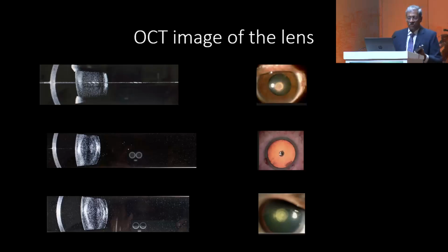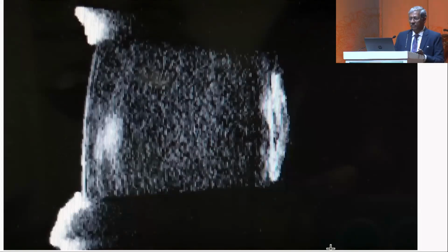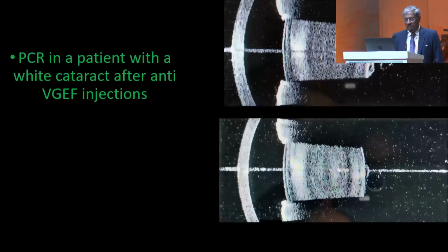The OCT also gives you an OCT image of the lens. We all deal with posterior polar cataracts, and we are worried that we're going to have a problem intraoperatively. But when you see a beautiful posterior capsule like the second and the third, we don't have to discuss the risk of PCR with these patients because they'll have a routine intraoperative procedure. This is an IOL Master lens picture from a person with a posterior polar cataract where you can see a nice bulge of the posterior capsule. So this patient probably will have to have the discussion about increased risk during surgery.